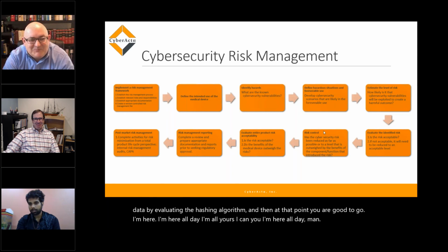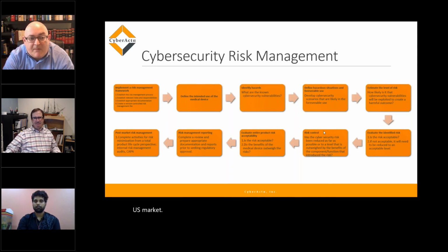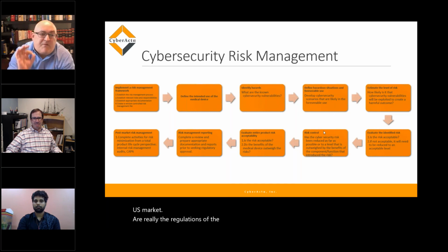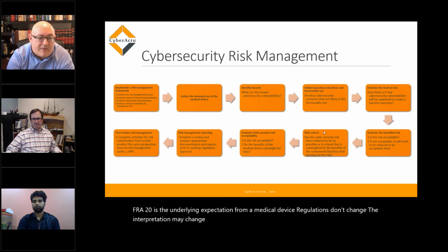Shahina is asking which regulation we should comply with before going with our software as a medical device in the US market. Really, the regulations are the same. Strictly from a regulation standpoint, 21 CFR 820 is the underlying expectation for a medical device. The regulations don't change. The interpretation may change by each agency, but the regulatory framework is still the same.